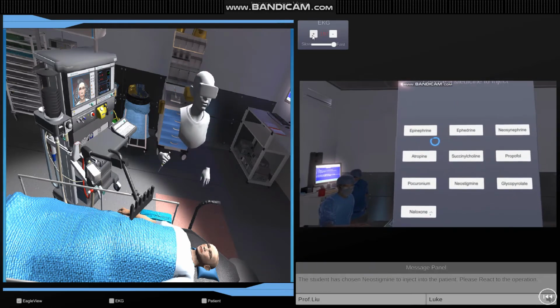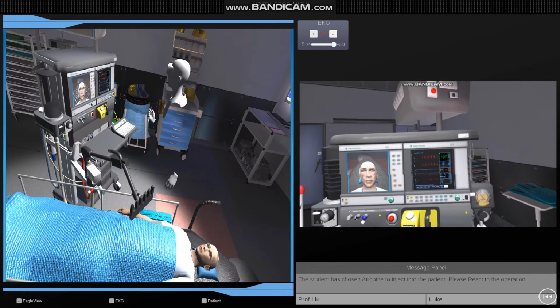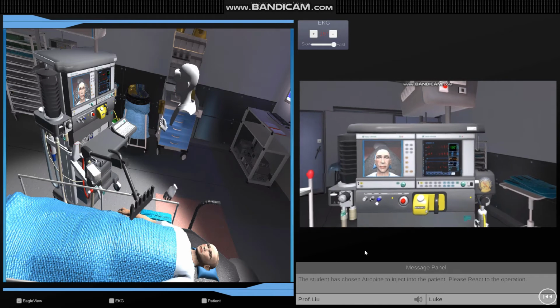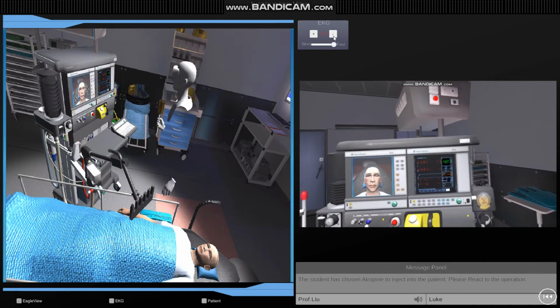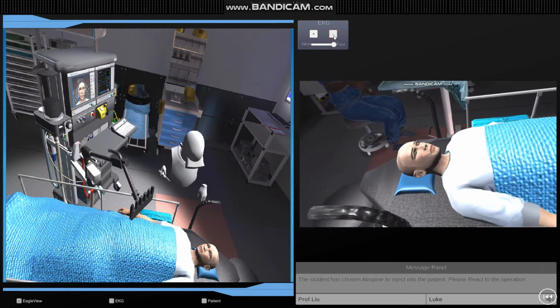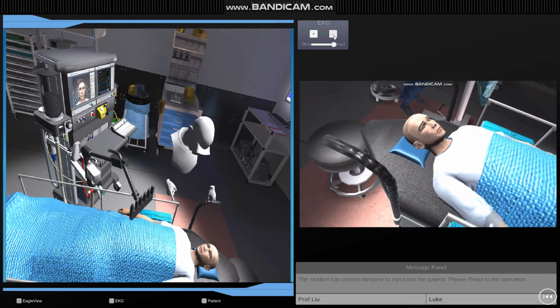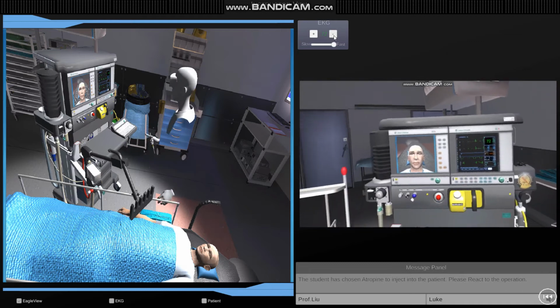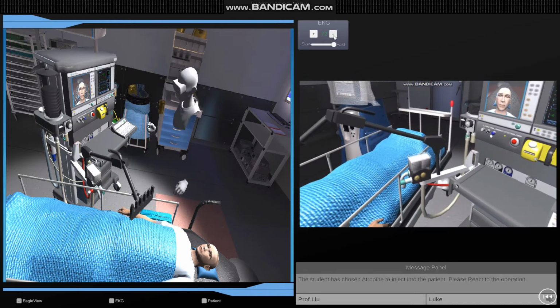The last one, we're going to use atropine. Hope we can save him. Yeah. Okay, now I can see you have chosen the atropine. The atropine effect is it will just drag the heartbeat to a normal range. Oh, it's getting better. Slowing down. Great, great. We did it. So that's basically the flow of this simulation.